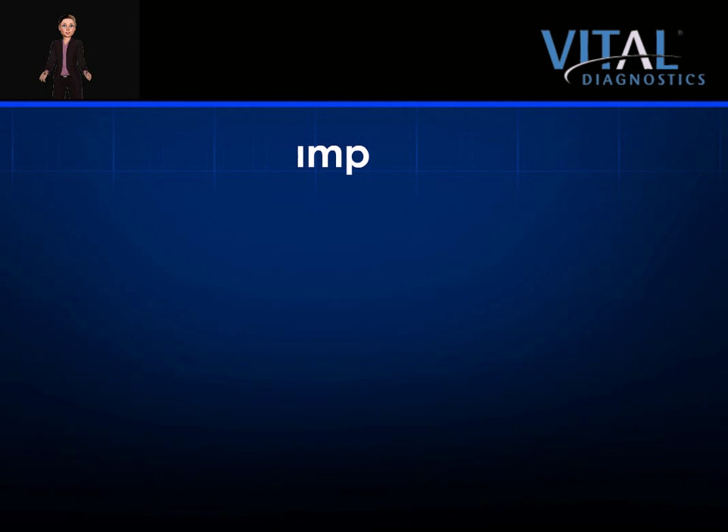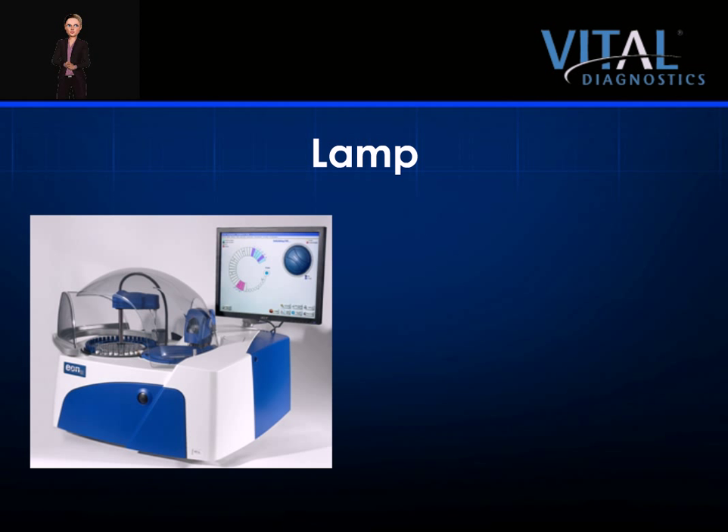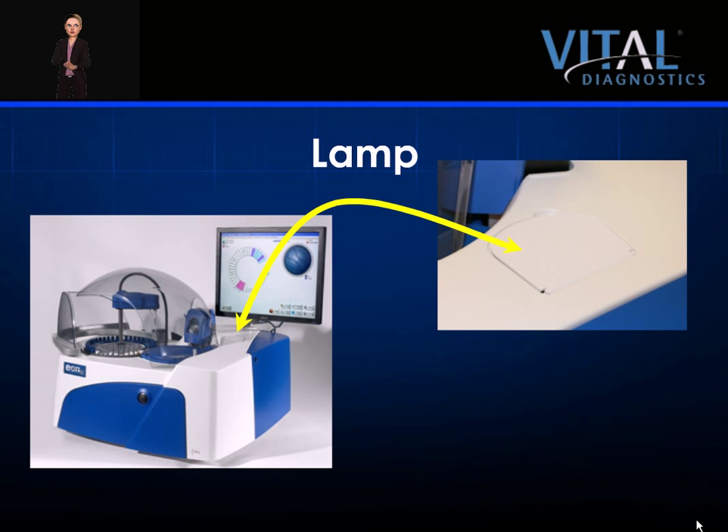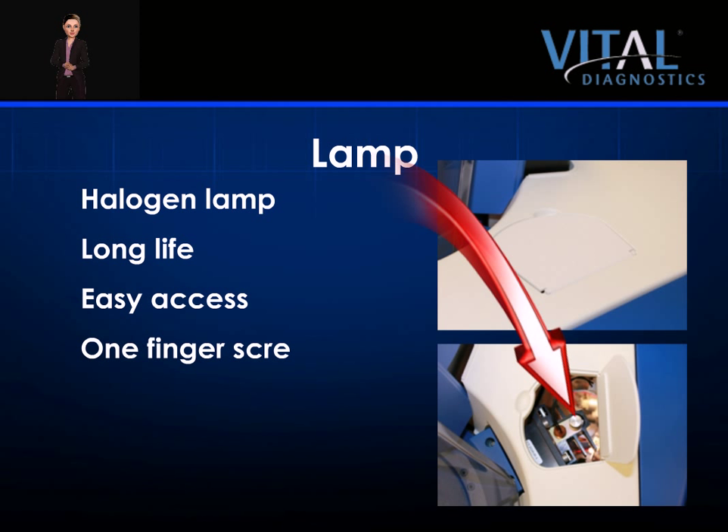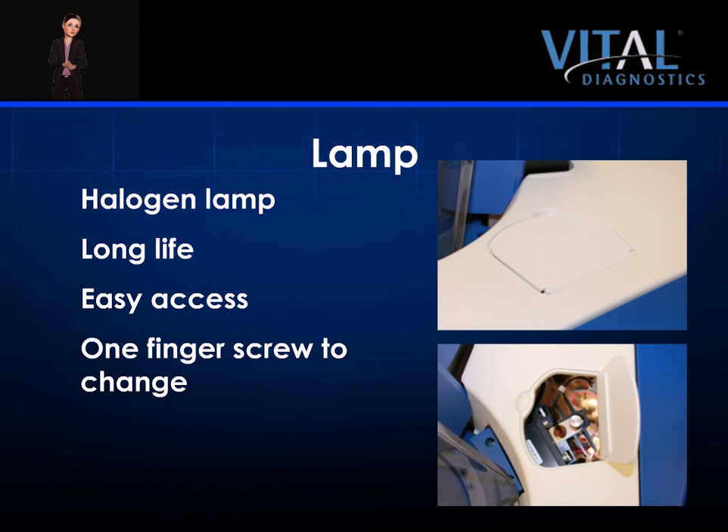The EON100 utilizes a halogen lamp for its light emission. The lamp is located under the small panel door on the top right side of the analyzer, just below the monitor mounting arm. The long-life halogen lamp is accessed through this small panel door. To change a lamp, merely remove one screw by hand and lift the unit. There is no alignment needed upon placing a new lamp in the instrument.